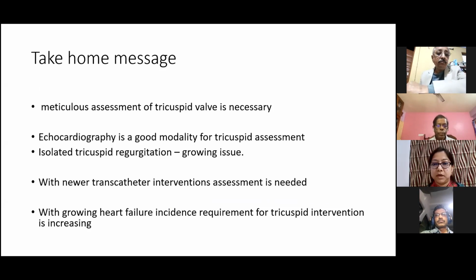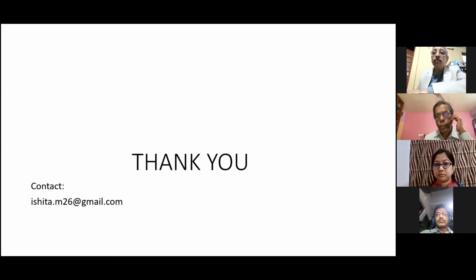Echocardiogram is a good modality for tricuspid assessment, though for volumetric assessment CMR is better. Isolated tricuspid regurgitation is a growing issue. With newer transcatheter interventions, assessment is needed. With growing heart failure incidence, the requirement for tricuspid intervention is also increasing.